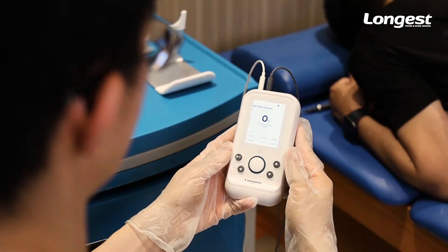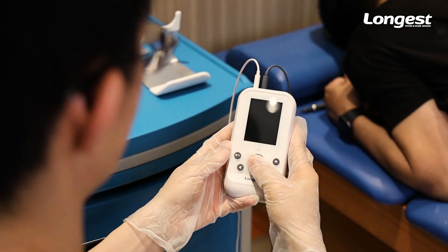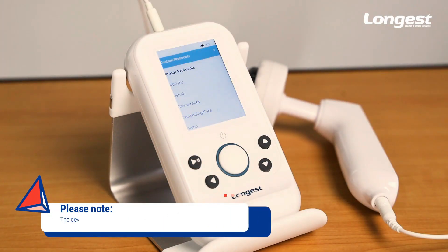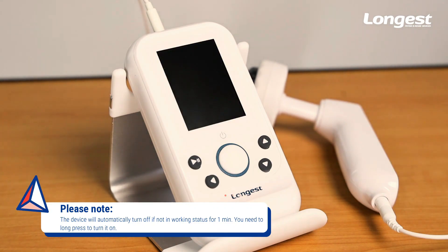After completing the treatment, long press the central button to turn off the device. Please note that the device will automatically turn off after one minute if you don't operate it or the device is not in treatment status. You will need to long press the button to turn on the device again.